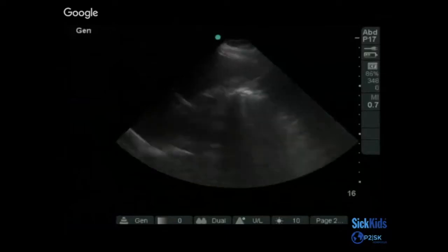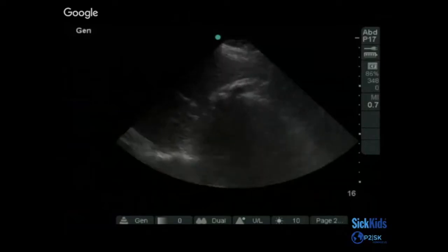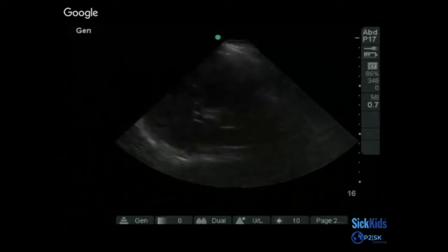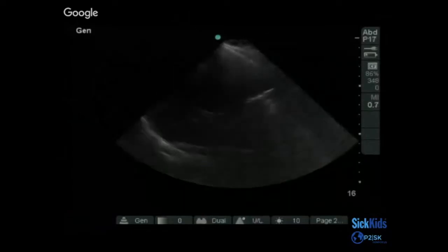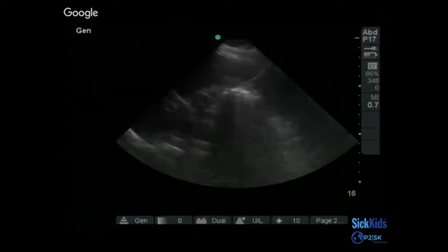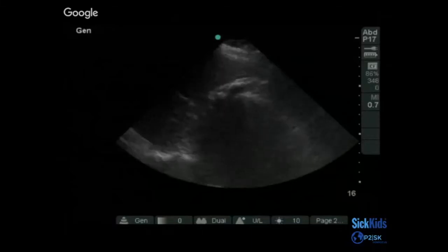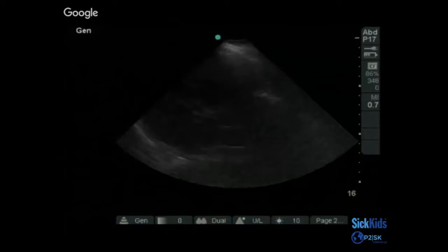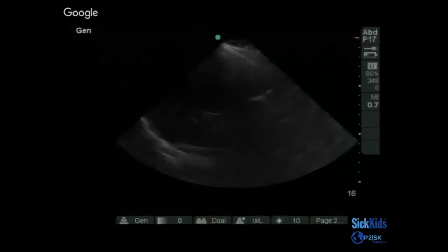So WES is wall echogenic shadow. And what that means is that sometimes you'll have a gallbladder where you have a number of stones, and then the gallbladder is collapsed. And so essentially all that's in your field of view, or your image, are the series of stones.